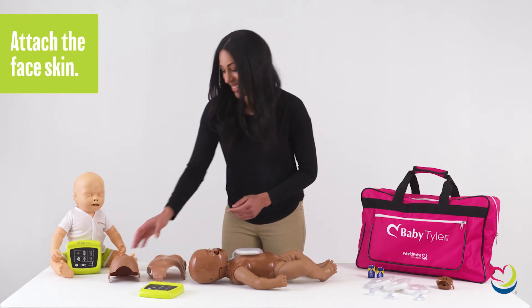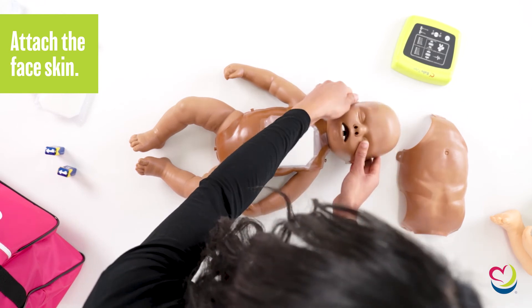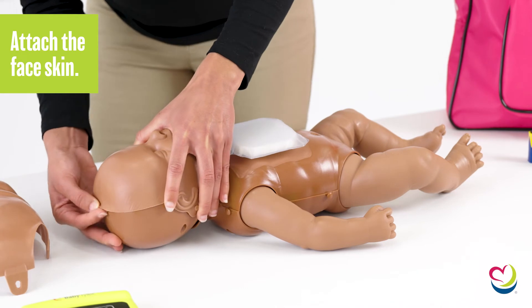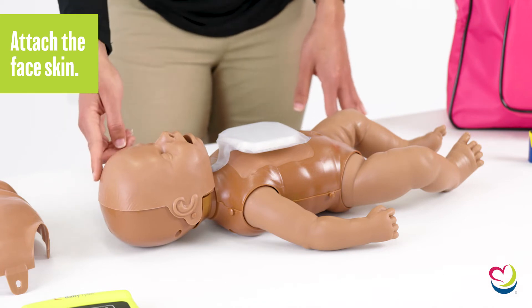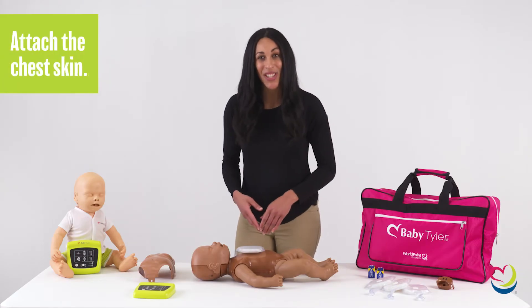After, fit the face skin, checking that the nose, mouth, and upper tab are in the correct position. Finally, place the chest skin and attach it to the studs.